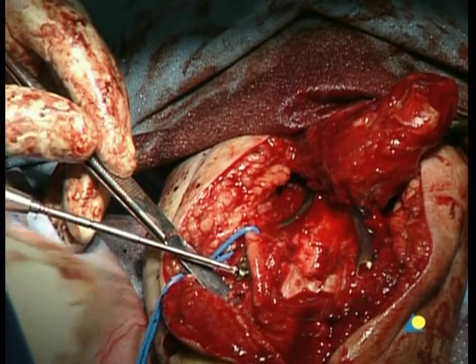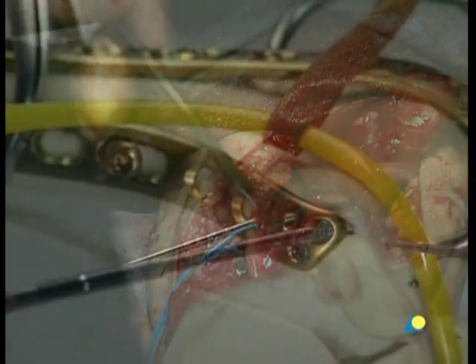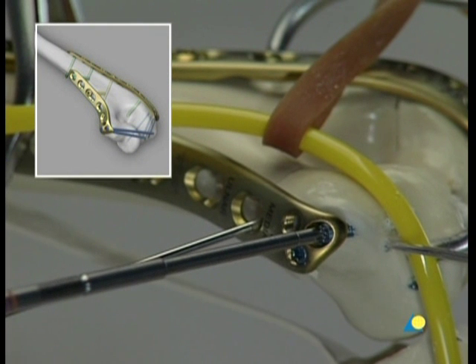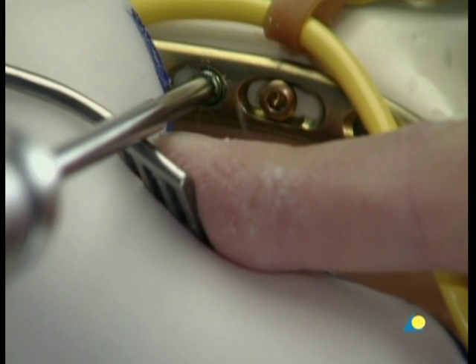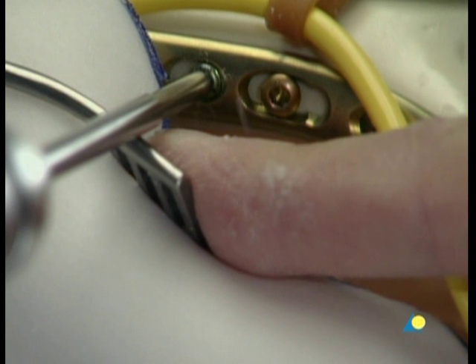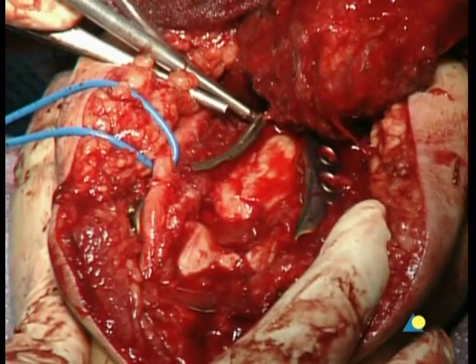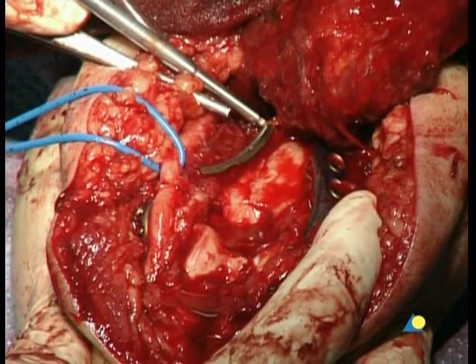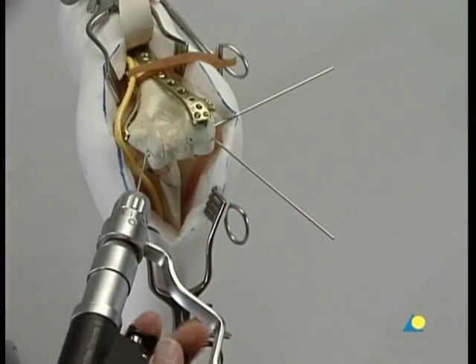The remaining holes are used for the insertion of additional screws. It is recommended that at least one screw cross the distal block on both the medial and lateral sides. The screws are 40 to 60 millimeters long depending on the size of the humerus. The fixation is completed with locking head screws. The procedure is repeated until all required screw holes in the shaft of the plate are filled. For optimal fixation to the shaft, a minimum of three screws inserted bicortically should be used. The K-wires are removed.